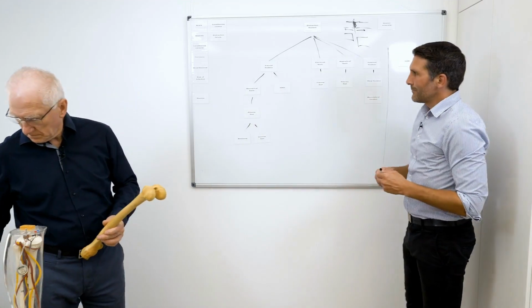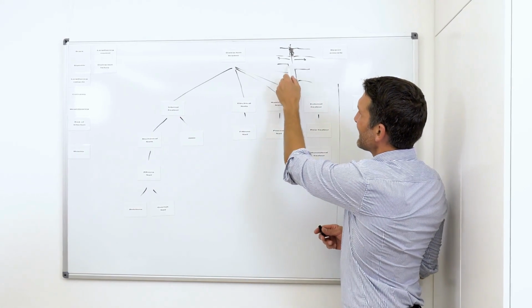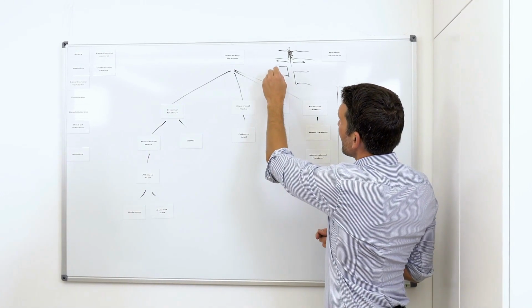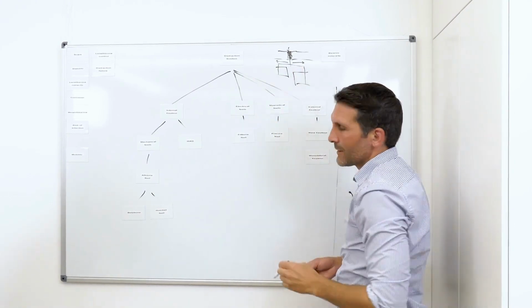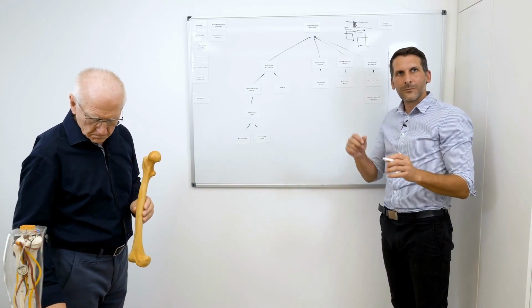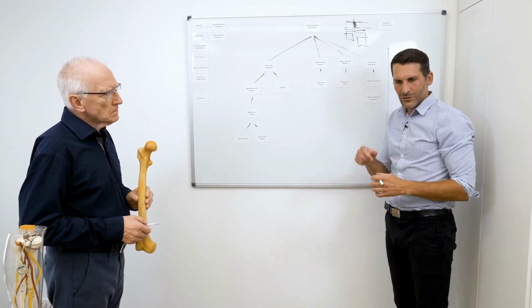That is simply based on the principle that you cannot create three-dimensional stability with it. That means if you attach a unilateral fixator here and try to pull the bone apart with it without internal stabilization, then it will inevitably lead to a shift in some dimension or direction.